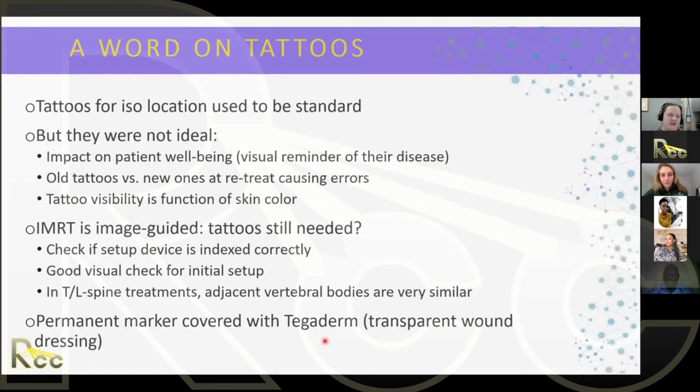We also found that we had patients coming back for retreatment because cancer survival rates are better. And if you have old tattoos versus new tattoos, that can actually cause errors because the therapist could select the incorrect tattoos for setup.